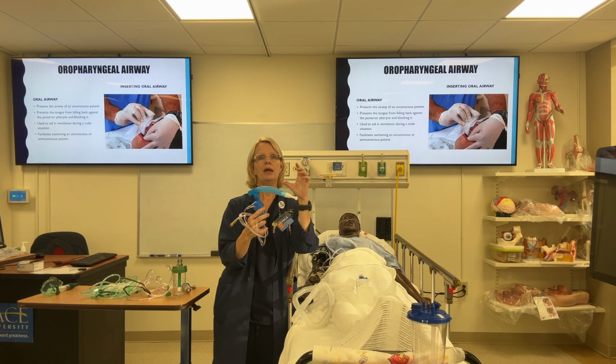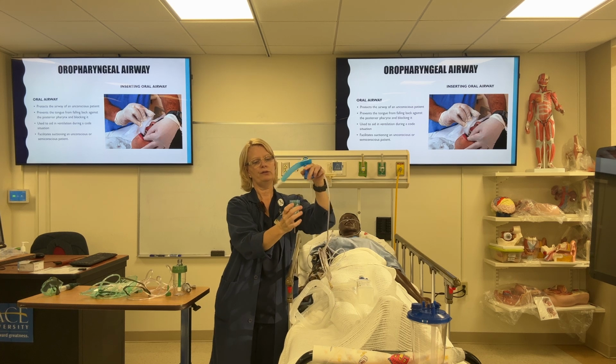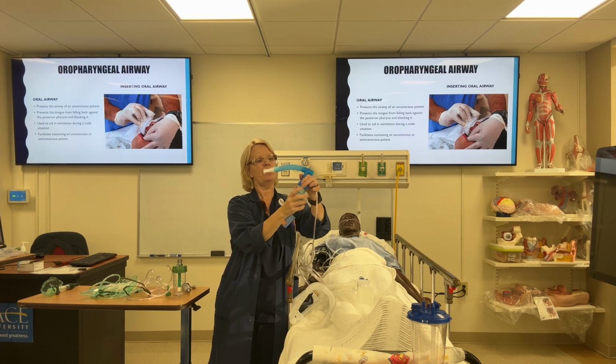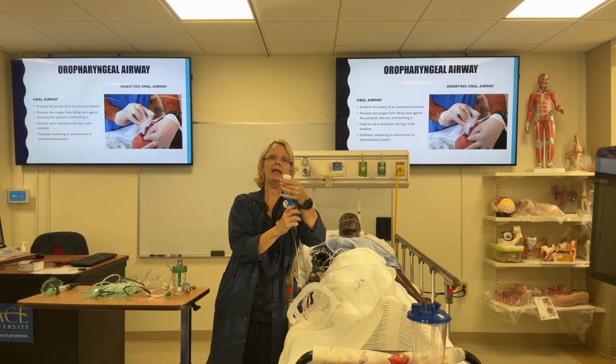It's a liquid. We put it into the aerosol chamber, right? We squeeze the liquid in, and then we close the chamber. We have the patient, if they're able to, hold it and use the mouthpiece, they can use that.